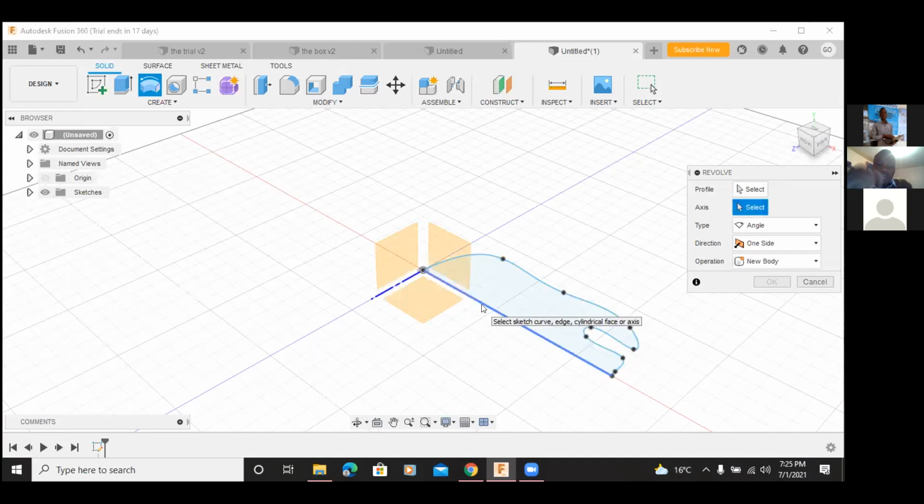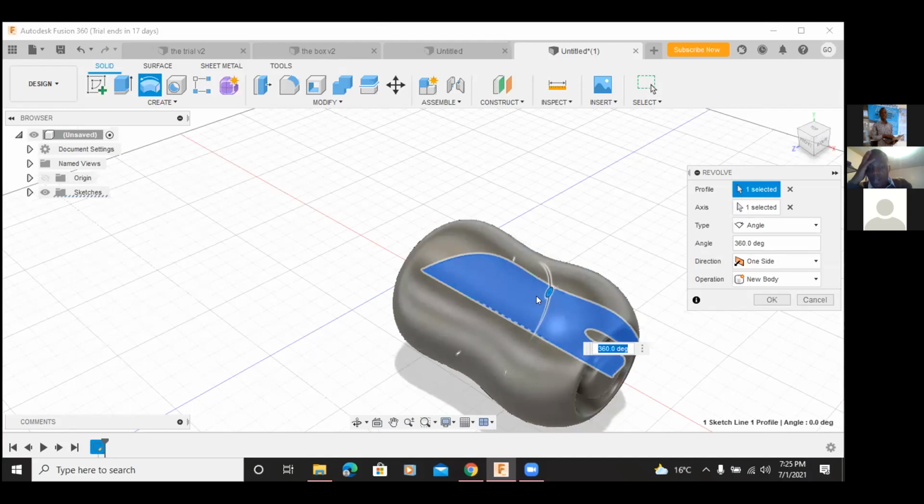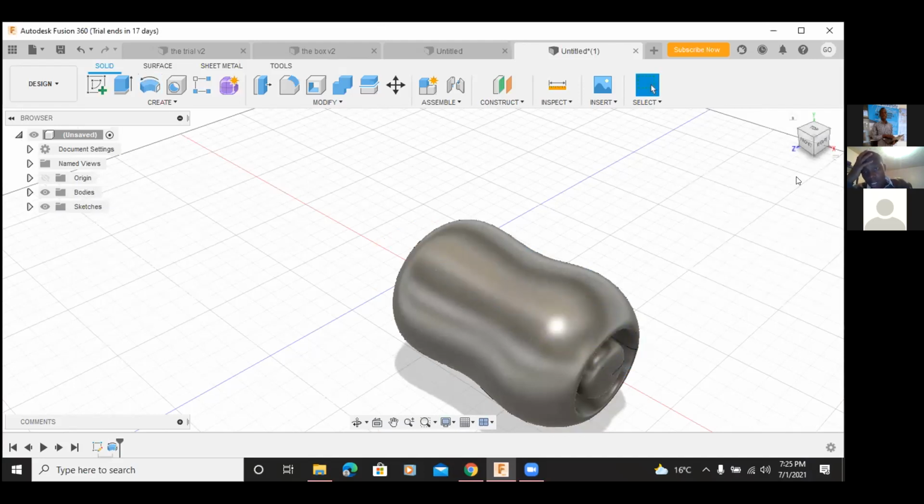Click on it. Click inside there. Click profile first. Select profile. Then click on that. Good. Now click OK.